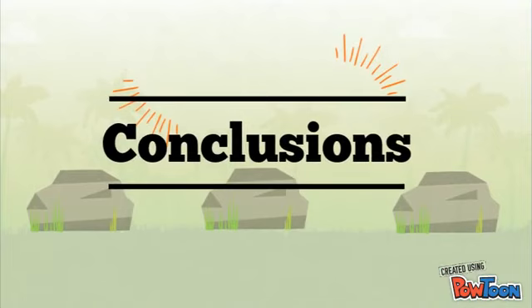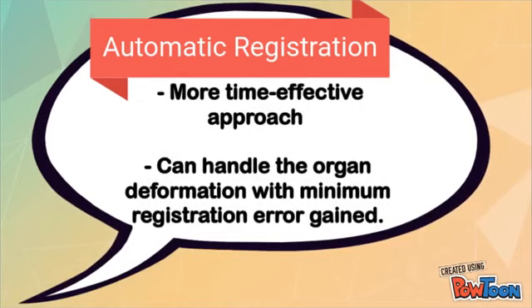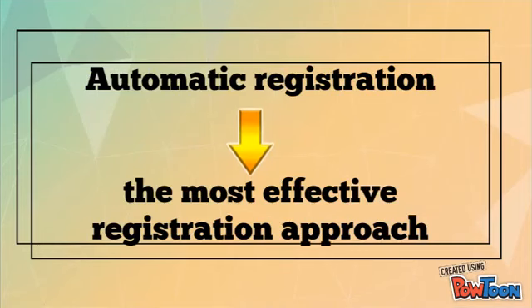Conclusions. The findings imply that automatic registration is a more time-effective approach, and it can handle organ deformation with minimum registration error. Automatic registration has been recognized as the most effective registration approach to increase the registration accuracy in laparoscopic surgery at the current stage.